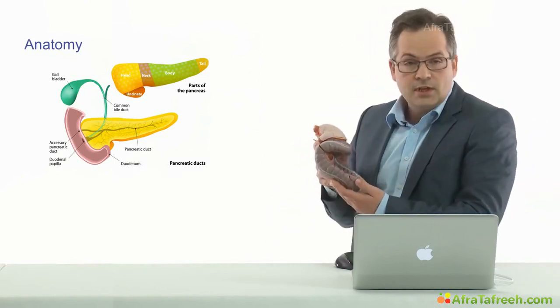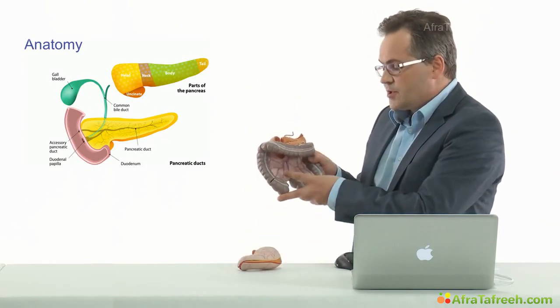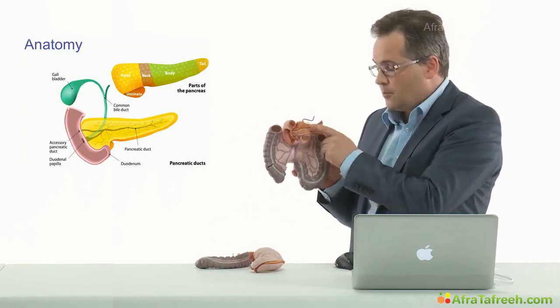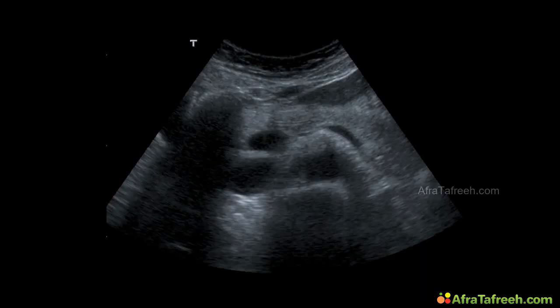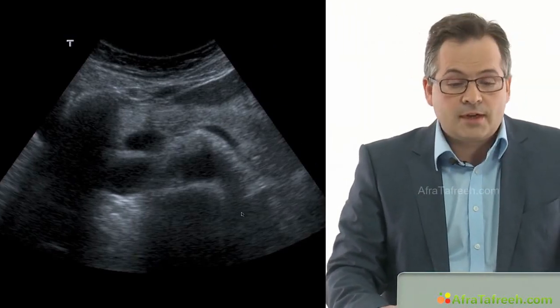So it's a really hidden organ. It's behind the stomach and even posterior to the gas-filled intestine. So I've got it, the pancreas with its head, body, and tail. But this was theory, and the problem was this. In this ultrasound examination picture, I did not find the pancreas at all. When I started scanning the patient, I had no idea what to find and where to find.